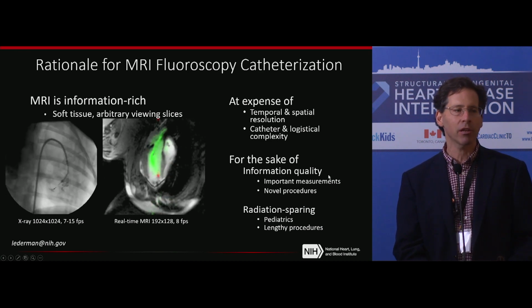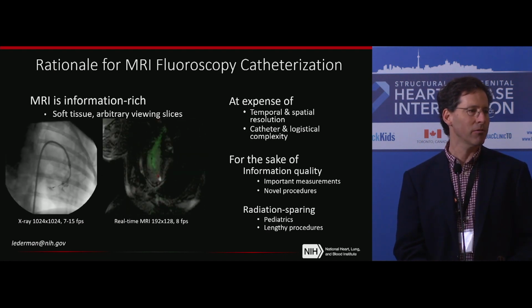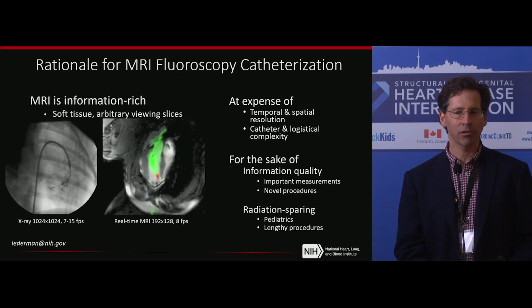So if you're telling me that pulmonary vascular resistance, which is a flow-dependent measurement, if that PVR value is important in clinical decision-making, then what the heck are you guys doing with your assumed Fick and thermodilution flow measurements? Because I'll argue that you're using a random number generator, and you might as well not take the kid to the cath lab. You might as well just roll the dice.